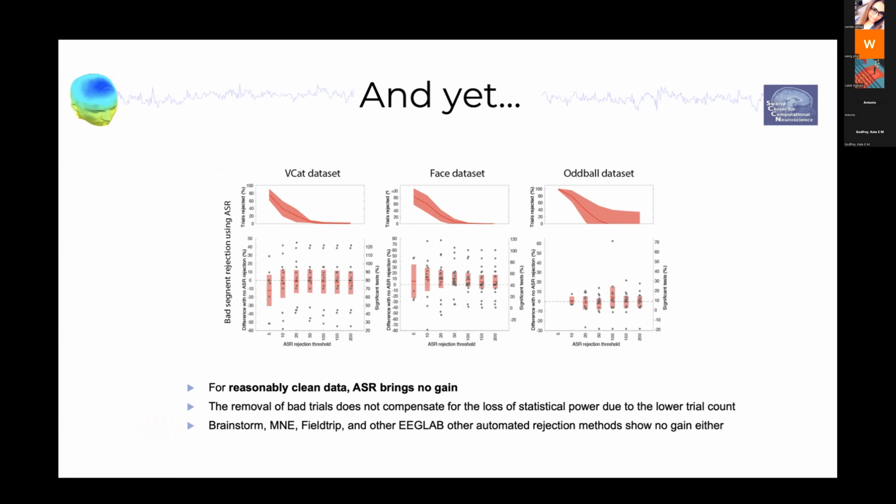And that's the main reason the paper is named "EEG is better left alone", because the consensus in the community is that you're going to take EEG, you're going to reject bad portions of data, and your effect will be more robust. What this tells us is that even though the noisy epochs we remove are gone, and we compute all the effect sizes with the remaining ones, the gain in signal-to-noise ratio we get by removing epochs doesn't compensate for the fact that we lose statistical power.